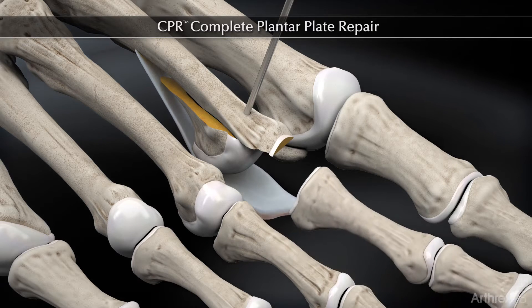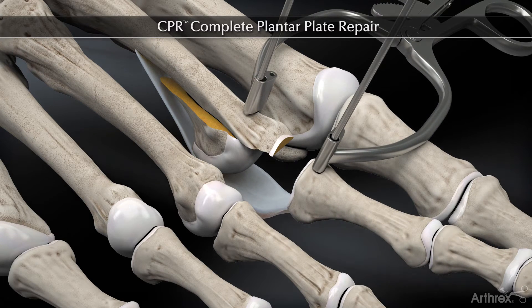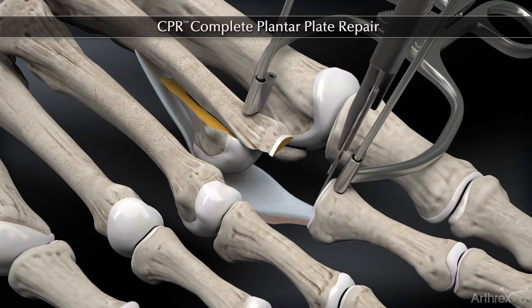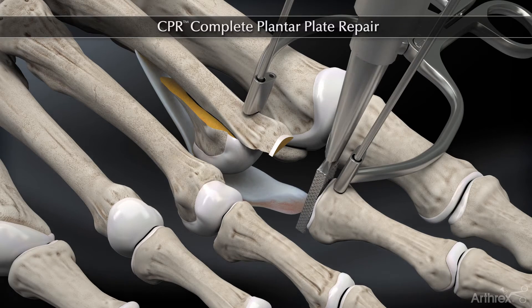A second vertical K-wire is placed in the base of the proximal phalanx, and then we can distract the joint itself. We release the deforming contracted capsule on the medial aspect, and that totally frees up the plantar plate.